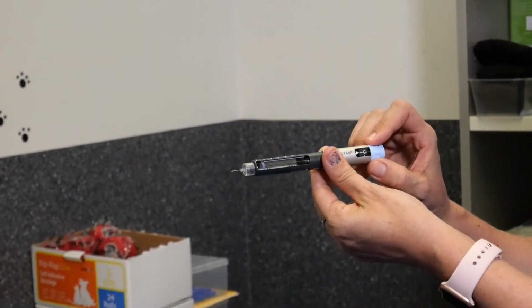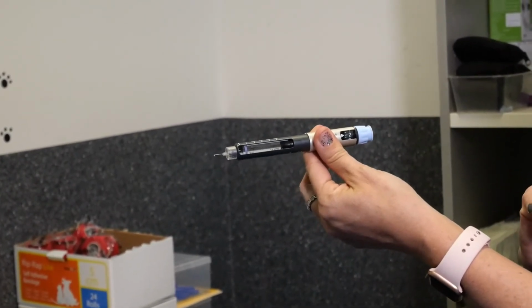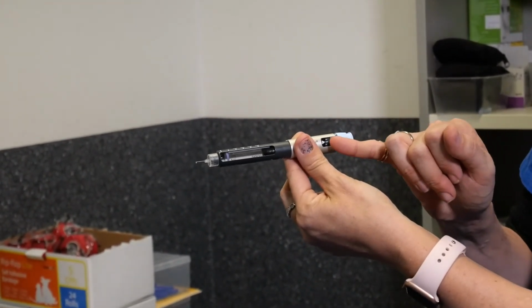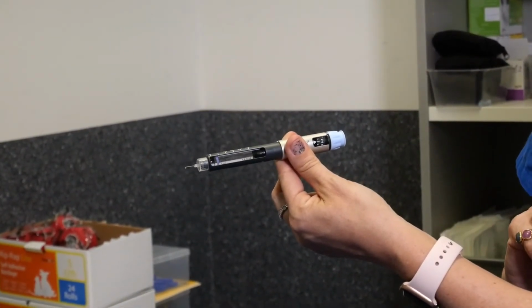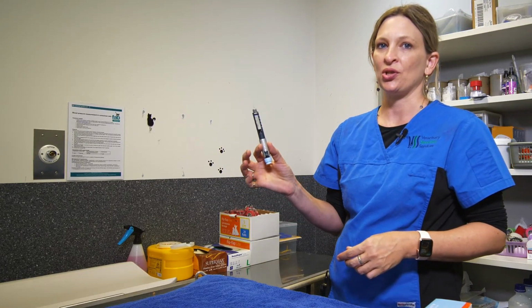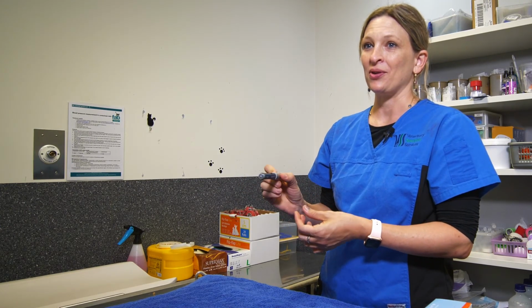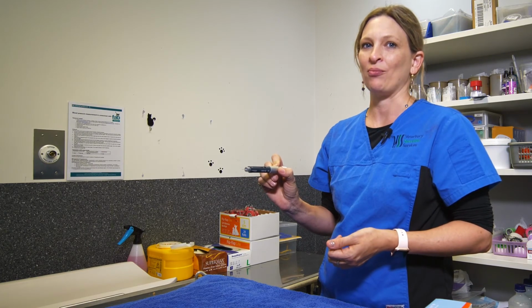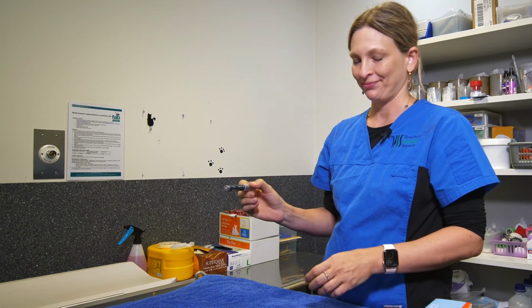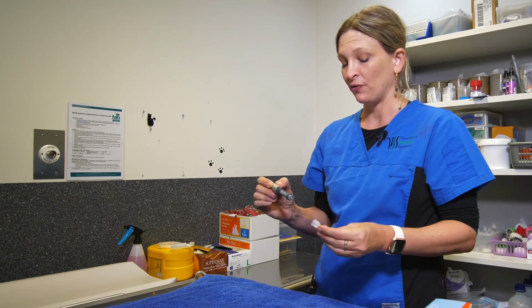For example purposes, we'll say that our patient is on a 2-unit dosage. So we've turned to the number 2 here, and we'll then inject the insulin into our cats. We'll have another video that will show you how to give an injection to your cat shortly. So hopefully that's been a helpful demonstration for you.